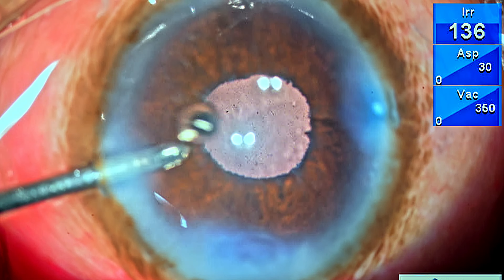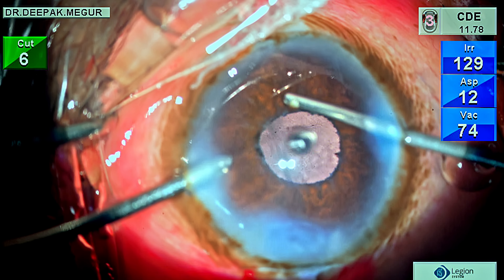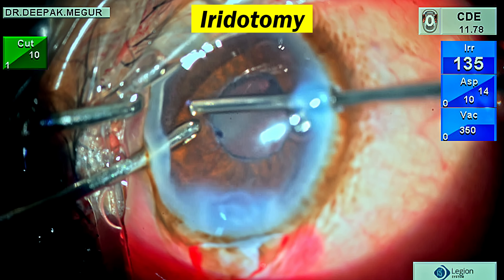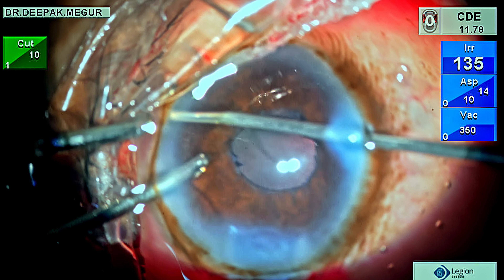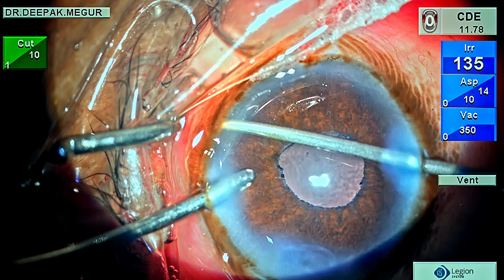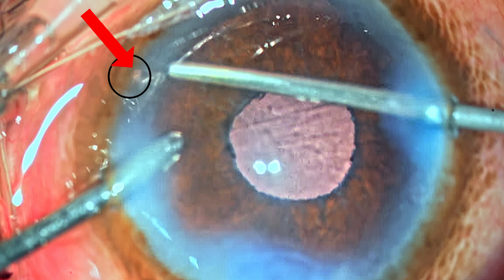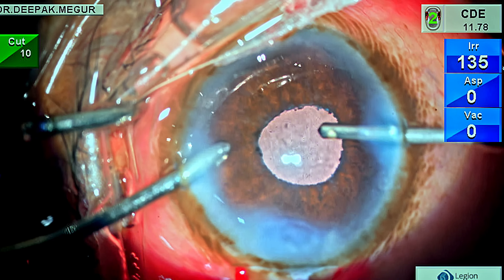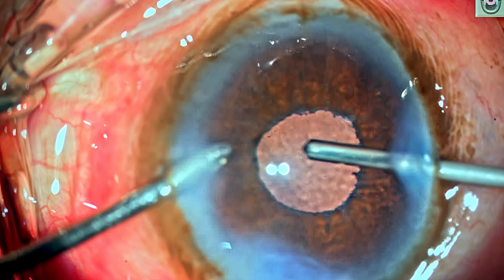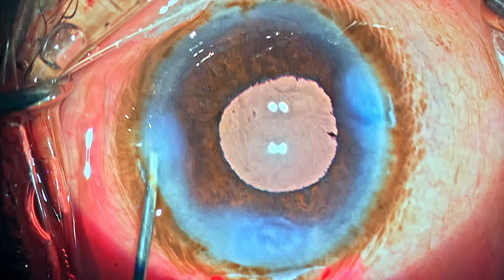In this eye I've also decided to perform a peripheral iridectomy because I'm not sure there could be a peripheral blob of vitreous, and I don't want any pupillary block phenomenon. The cut rate is set at very low flow rate and vacuum, using IA-cut mode — irrigation, aspiration, then cut. A single cut creates a small iridectomy at one o'clock. One last anterior vitrectomy pass is performed in the pupillary area, then stromal hydration and intracameral antibiotics are placed and the case is done.